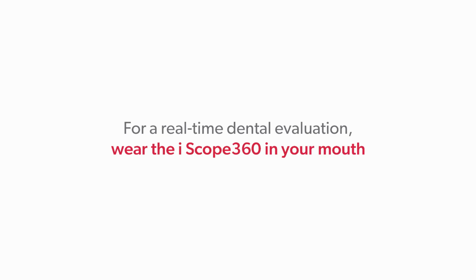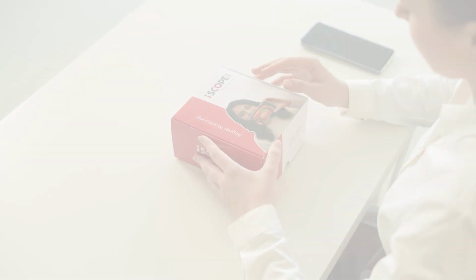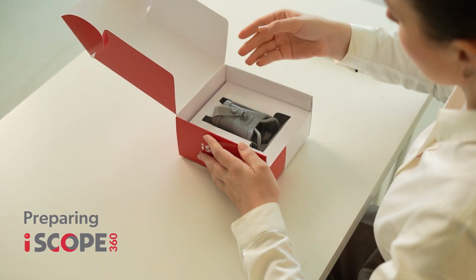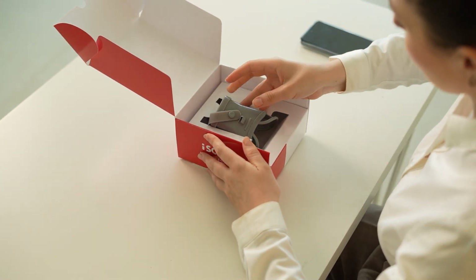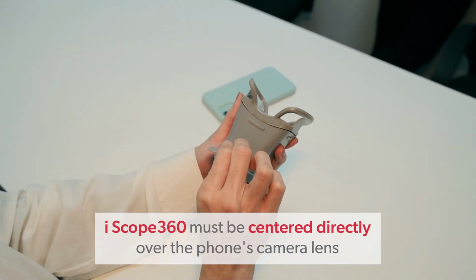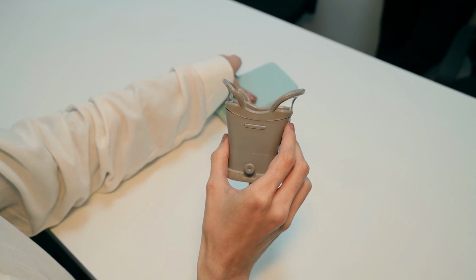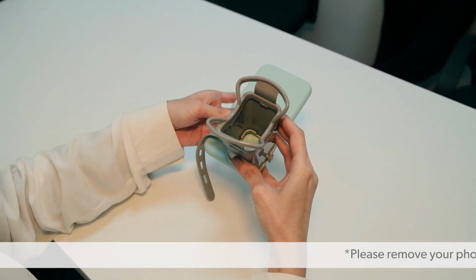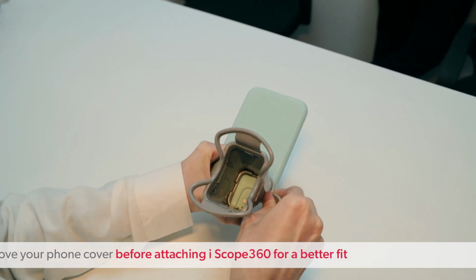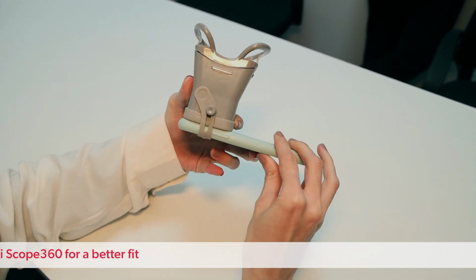For a real-time dental evaluation, your dentist will ask you to wear the iScope 360 in your mouth. While keeping the call on, just attach the iScope 360 to your smartphone, while ensuring that the camera lens is at the center of the iScope 360. Any shift in this position will prevent you from capturing intraoral pictures properly.